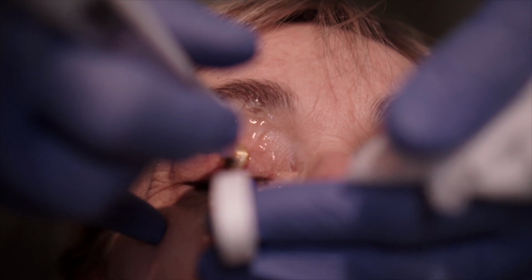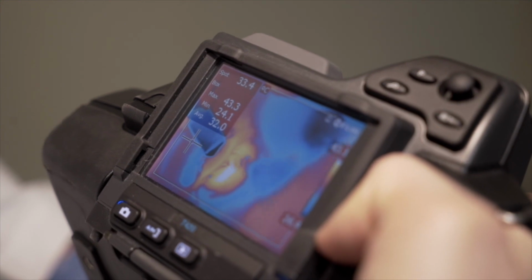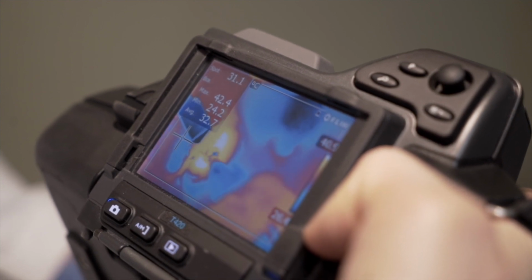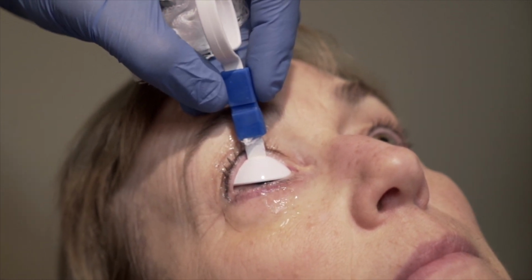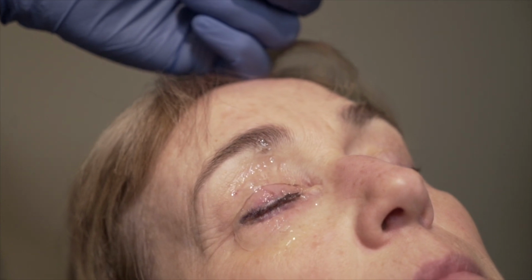We do this for a third, fourth, and fifth pass, but after the third pass, or once 42 degrees centigrade has been attained within the heated sections, express the meibomian glands using a vertical motion, offering a distal to proximal orifice massage. This expresses the oil from the deep part of the gland up to the lid margin and purges the gland of waxy debris. Then repeat on the opposite lid, followed by removal of the shield and application of the thermaLid procedure for the fellow eye.